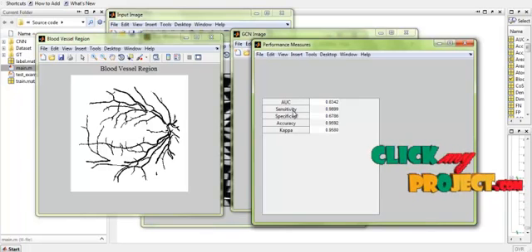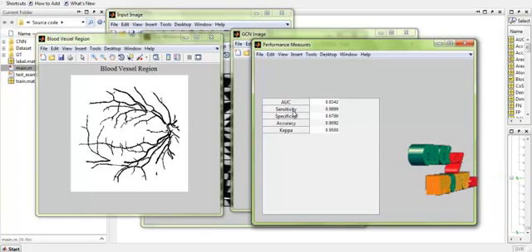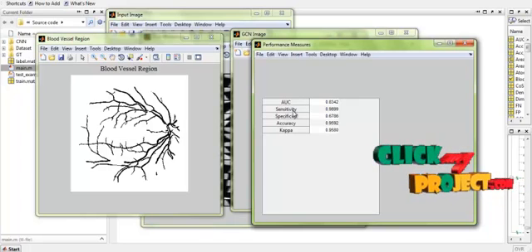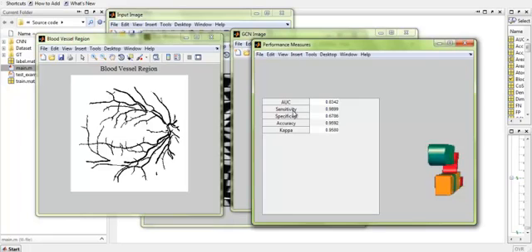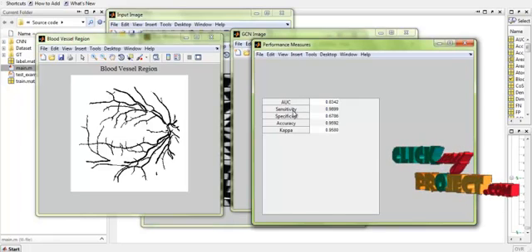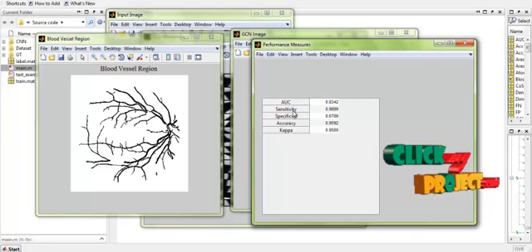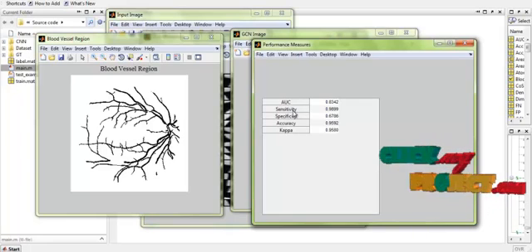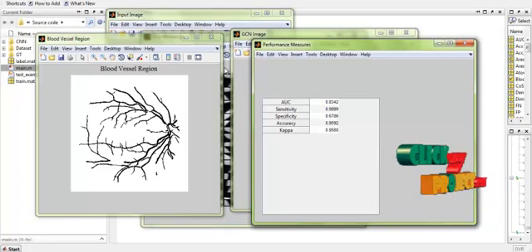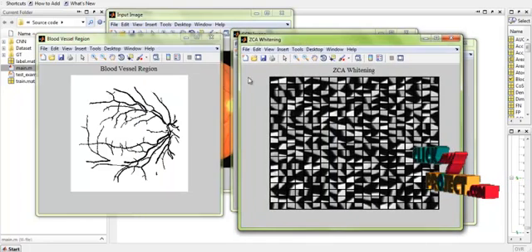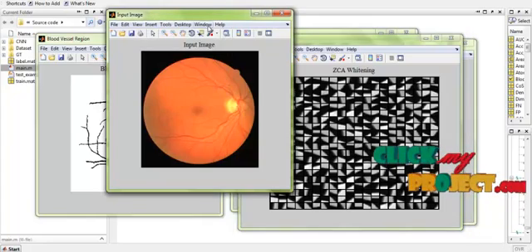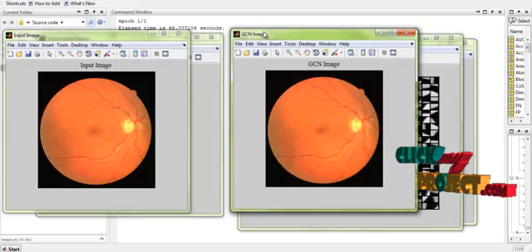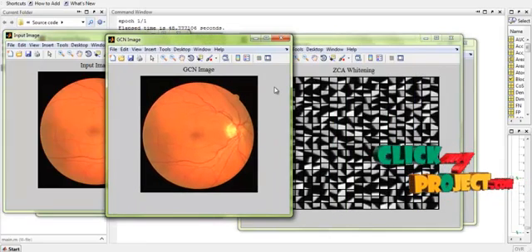Thus, we have segmented the blood vessel regions using the convolutional neural network process. The segmentation process is based on classification using neural networks, preceded by pre-processing steps based on zero-phase component analysis and global contrast normalization. Thank you.